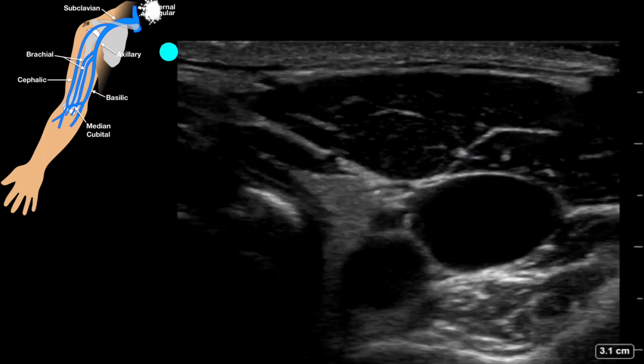And then lastly, now some people are doing supraclavicular. I've not had as much success with that simply because the probes we have are pretty big and they seem to take up the space and I can't get access to them as well. After the subclavian, the internal jugular is my next best choice.